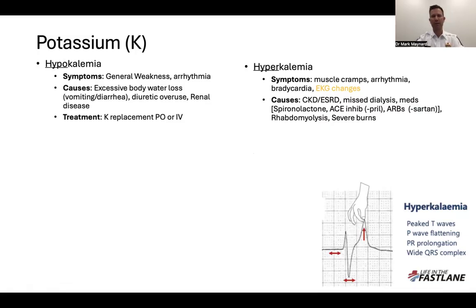Of course, you got a patient who's in rhabdomyolysis. Now, you won't know that for sure because we don't have the ability to check for a myoglobin or CK in the EPOC system. But if they were exerting themselves on a hot day, not drinking enough fluids, you may be able to see that their creatinine is elevated, but their potassium might be elevated, and that might fit the clinical picture for rhabdomyolysis. Severe burns can also lead to hyperkalemia.